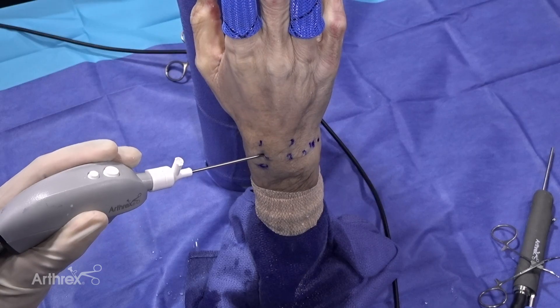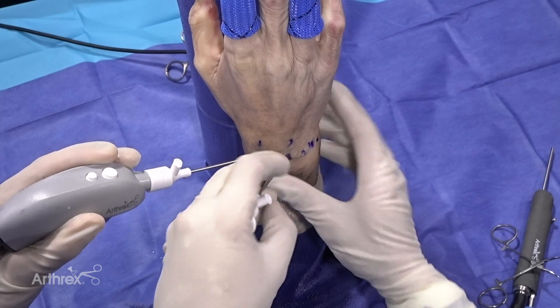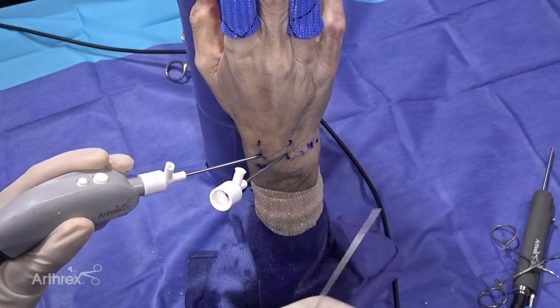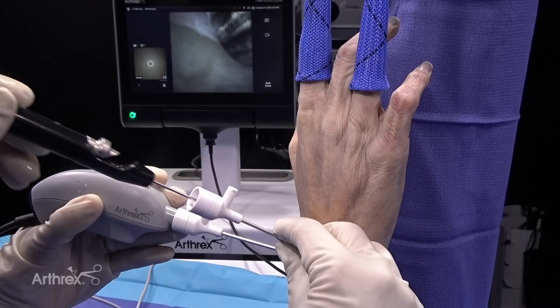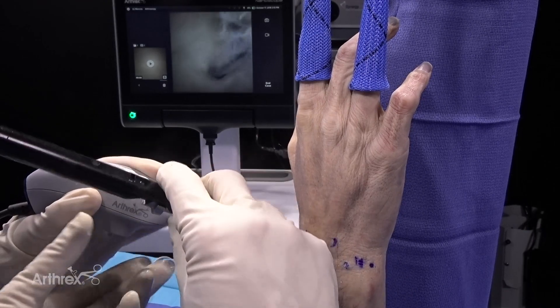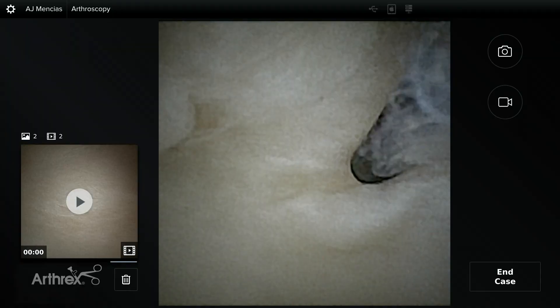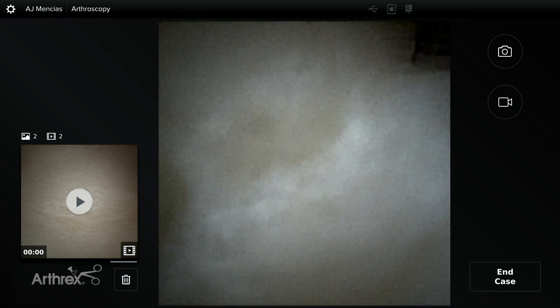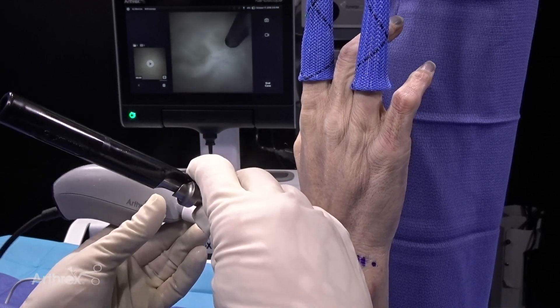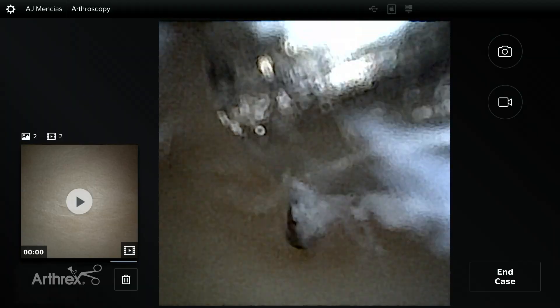One of the other things we can do with the nanoscope is insert an inflow cannula, and as you're evaluating the TFCC we can insert the nitinol probe — which is two millimeters — deploy the probe, and then the ability to really test that TFCC fraying is unbelievable. Right now I'm also testing the trampoline effect of the TFCC, and I think you can see that the trampoline effect is intact.